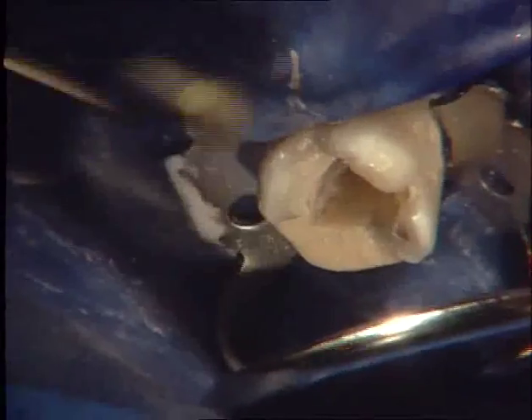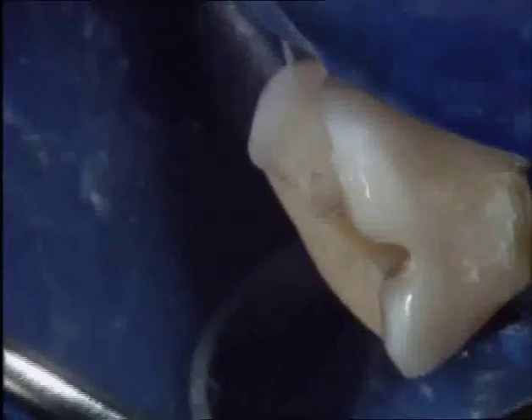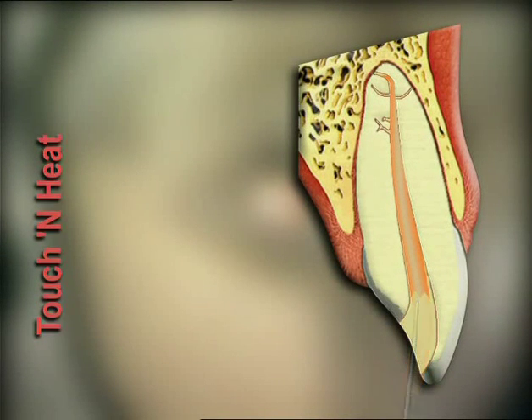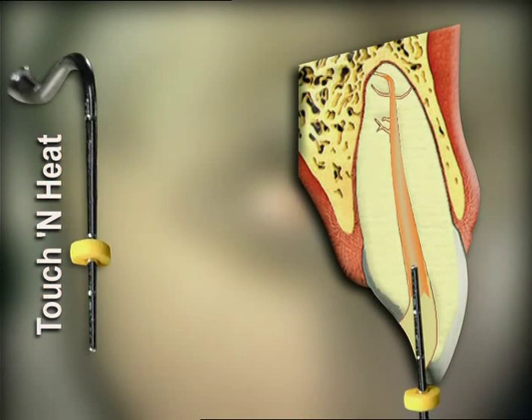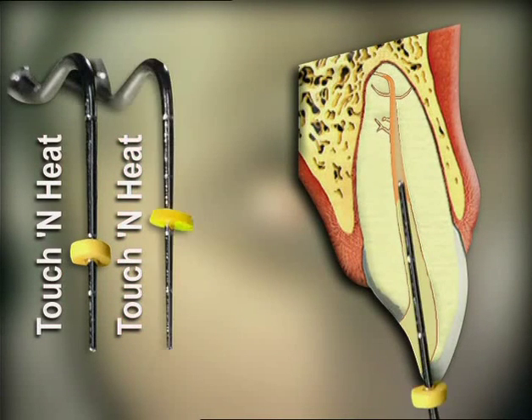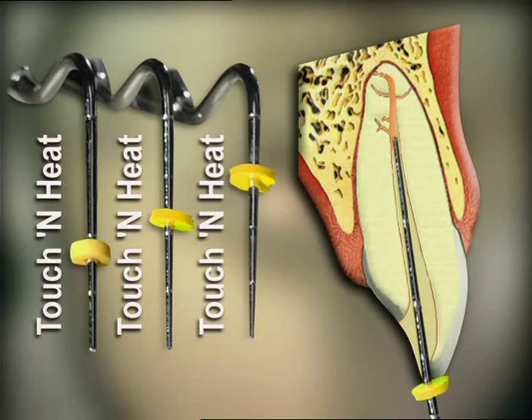Following the latest heating and gutta-percha removal cycle, a sustained vertical press on the plugger for 10 seconds will produce the final wave of condensation. This will effectively offset any shrinkage that may occur during the gutta-percha cooling cycle. The downpacking is characterized by the rhythmic heating with the probes and compaction with pluggers of decreasing size. In most instances, the apical portion of the preparation is sealed when compaction is occurring 5 to 7 millimeters from the apex.